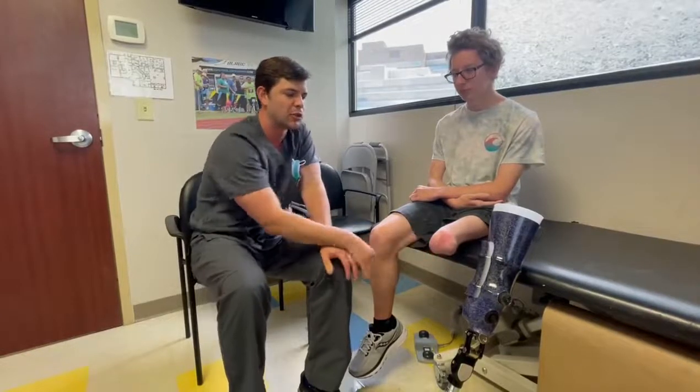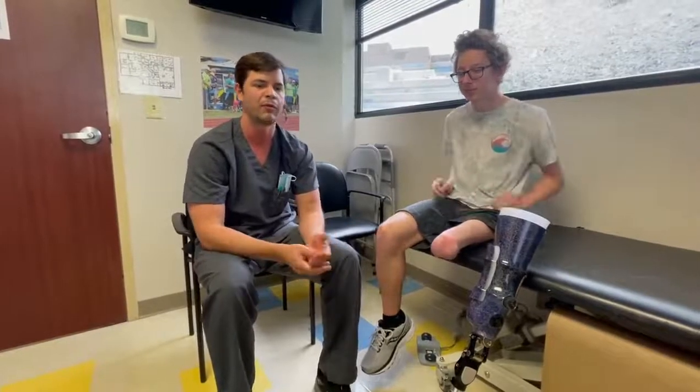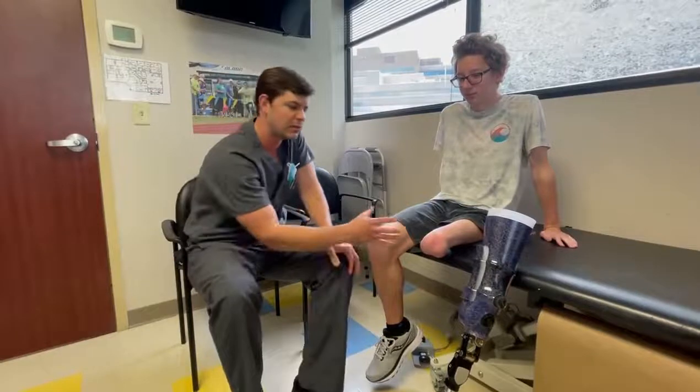We had to get creative with the socket design to eliminate gel liners, take advantage of his anatomy, and promote good bone density. Aiden lives in Arizona, so wearing liners in the heat is a challenge — and if you can eliminate liners for certain amputation levels, that's what we try to do. Liners are expensive, especially for a growing kid who needs replacements more often than every six months. Getting a 14-year-old to wash liners every day is also a challenge. This is a more hygienic, lighter-weight, low-maintenance prosthesis — no lanyard straps, no puck on the bottom, no liner. All he does is apply hand sanitizer to his leg and slide down into the prosthesis, whose interior is shaped to his anatomy.